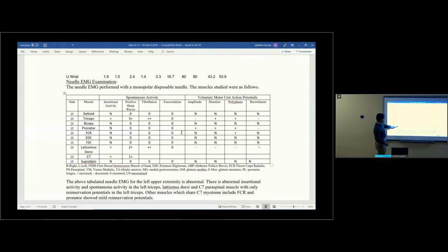No active denervation. So then in that case, what do you do? So what you have determined when we talk about radiculopathy should be the muscles that are innervated by the same nerve root, but by two different nerves. And if you look at the nerve root, it's coming out, and then it gives off a dorsal branch, and then the ventral goes up to make the plexus. So if you have an entrapment at the nerve root level, then you should have the paraspinal muscles affected.